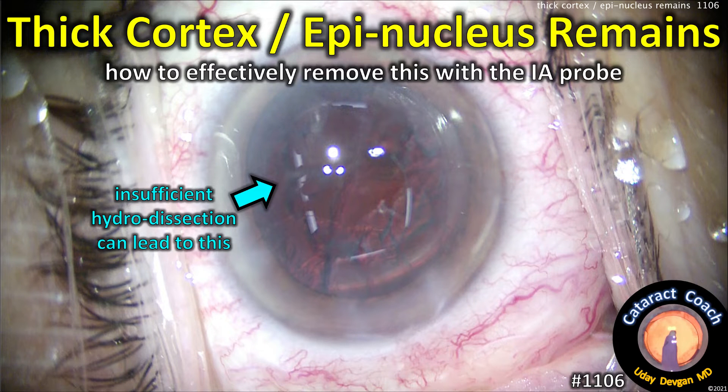CataractCoach.com. Thick cortex and epinucleus remains. How are you going to effectively remove this with the IA probe?